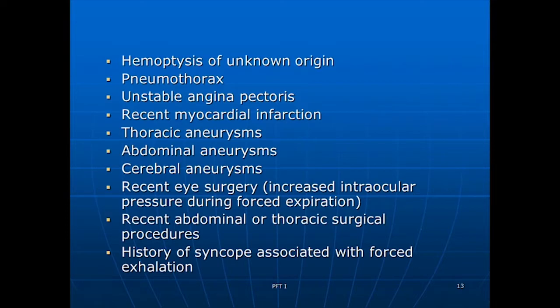And the last one, if you ever go to a pulmonary function testing site in the facility, you're going to see patients will often faint because there's a lot of forced expiration, and some of them are very, very weak, so they often faint. So anybody who has a history of syncope, you want to be really, really careful with them because, again, we're talking about a lot of effort in these pulmonary function tests, and there's a lot of increased intrathoracic pressure and lung volumes and whatnot. So you have to be really careful with these particular studies.